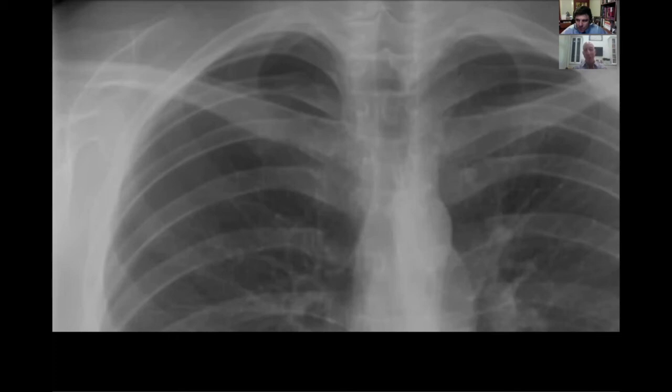And along those same lines, sometimes we have urgent care centers that'll send images that have been manually cropped with almost like a white framing. And any kind of extraneous light or whiteness around the image itself will take away from that contrast. So that's another thing you really want to avoid in your own centers, not your guys, but we see a lot of it from other locations where they have some things like that take away from the image quality.